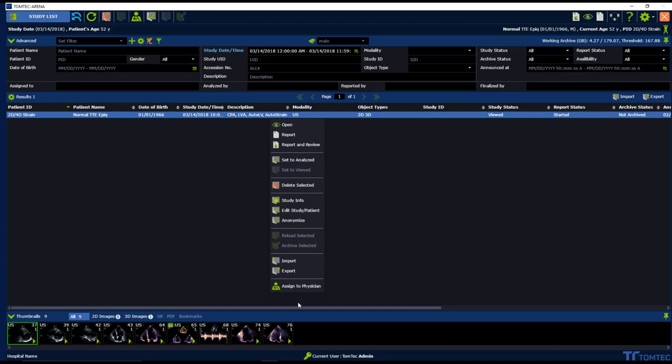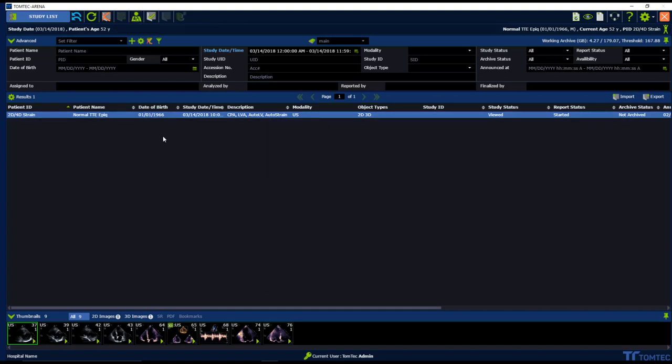Right mouse click on the study, we can assign to. You can also see the same icon on the top. Now let's work on the study.